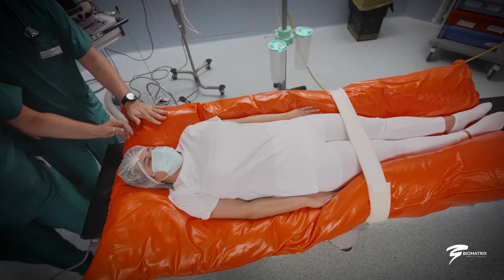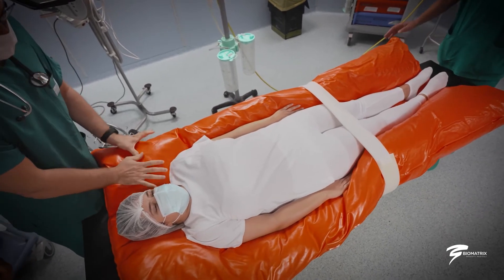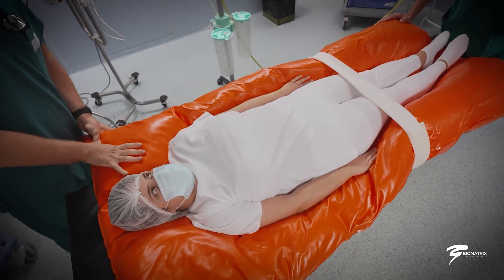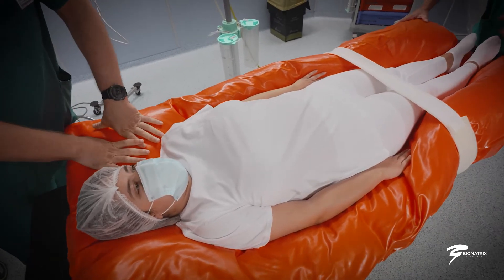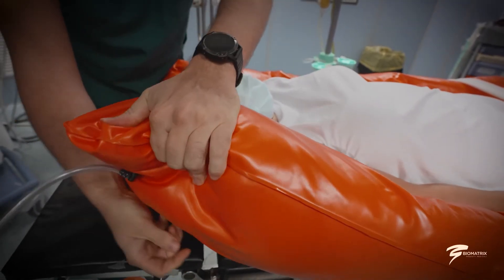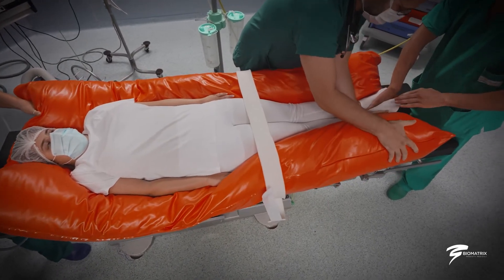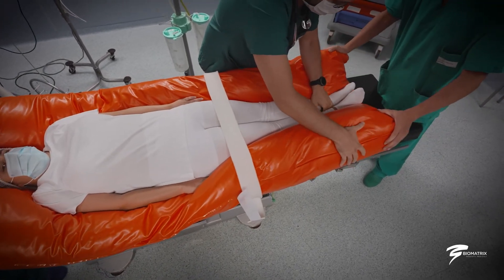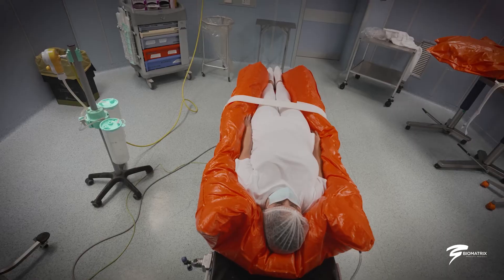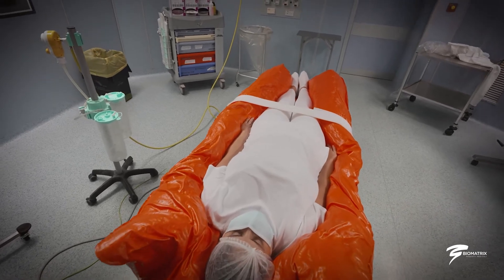The B vacuum positioners conform perfectly and firmly to the patient's body, guaranteeing safer positioning and greater stability. Using the B vacuum positioners, the patient is easily positioned on the operating table and, if necessary, can be quickly repositioned during surgery, saving valuable time for the entire staff.